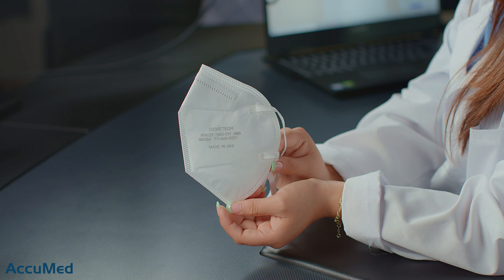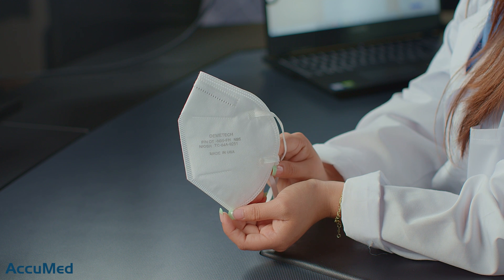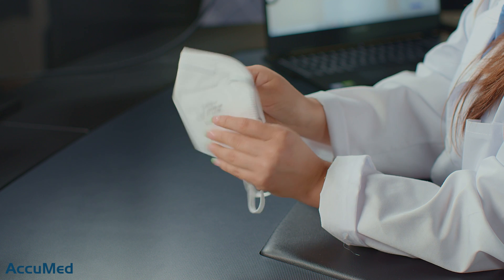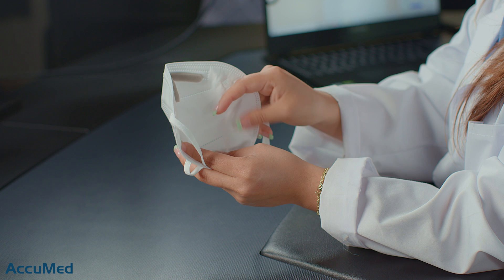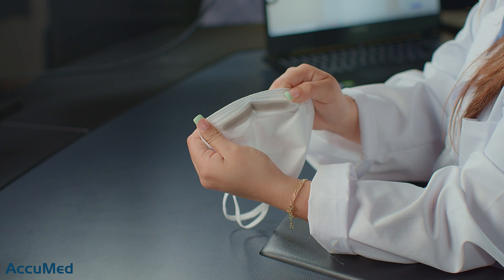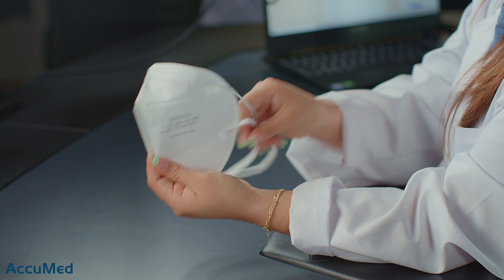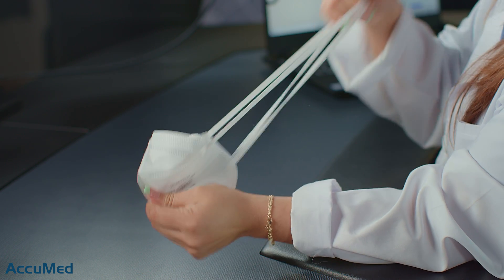Let's go ahead and take a look at these respirators. It is a bifold style and it does come with all of the N95 requirements. These aren't the best quality respirators in terms of construction or material texture, as they do feel very papery and rough. The material from the inside is not that soft, but it does come with a nose foam. This is a 4-ripped elastic headband, and they do tend to be less comfortable than other headbands.